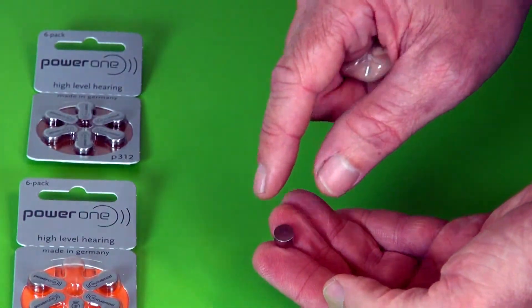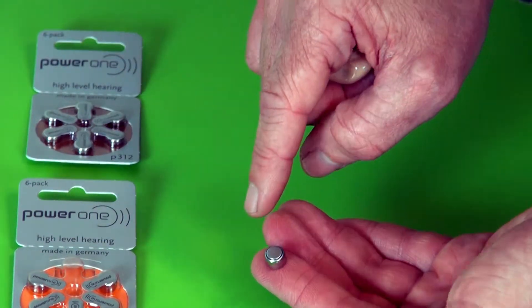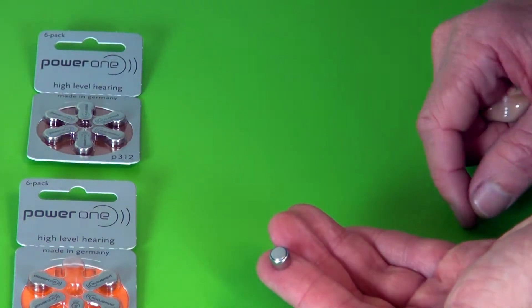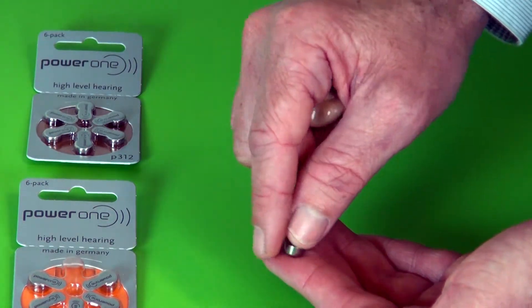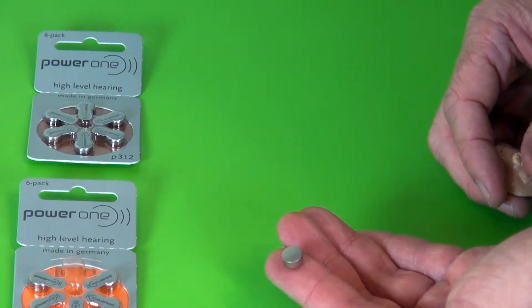There is a flat surface and then a surface with a little ring around it. The surface with the ring around it is the negative side of the battery. The flat surface is the positive side of the battery.